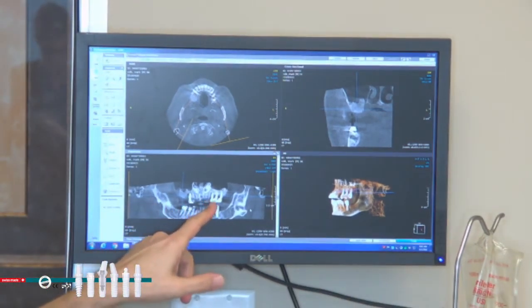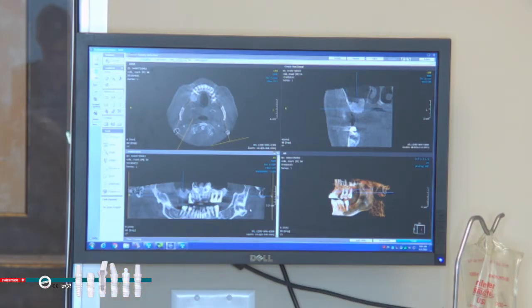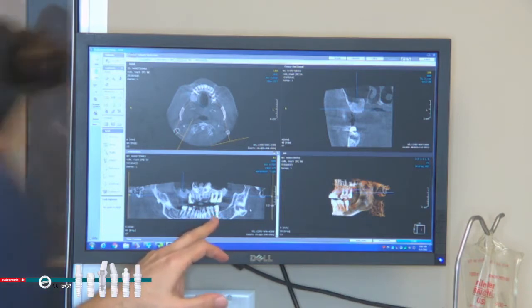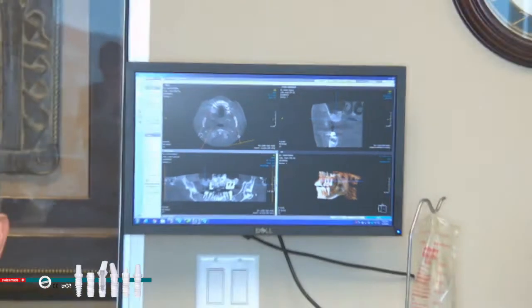And as you see here, he had 3 zirconia Z Systems implants placed on the upper left side to replace these teeth, which used to be titanium implants actually. And he has another titanium implant in the lower left that's doing well as well for now. So he's been a patient of ours for 12 years, and gradually going to have all titanium replaced with zirconia implants.